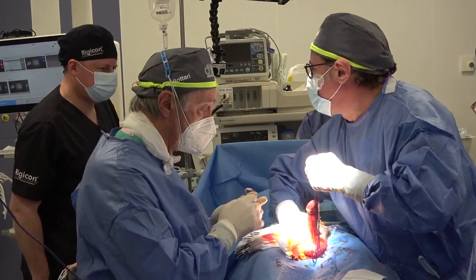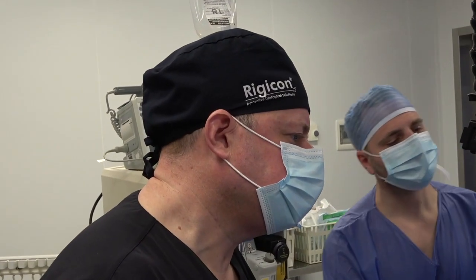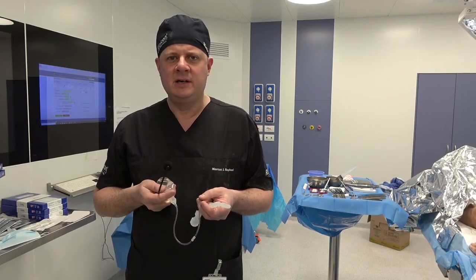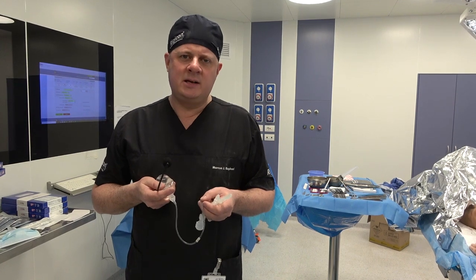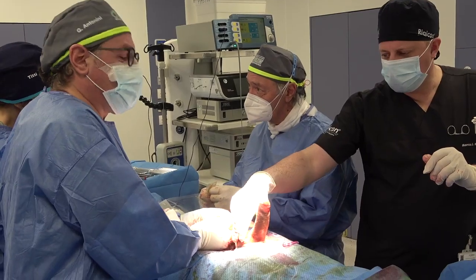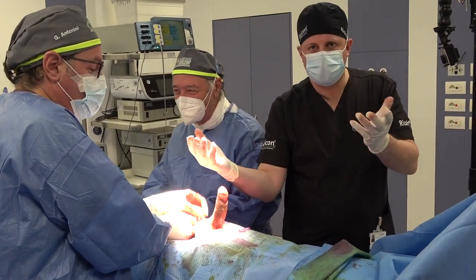Obviously with the implant being implanted, it really gets to do its job. And with a 20 cm that we've implanted with just 2 cm rear tip extenders, we've really ended up with a very, very nice result here. I think this patient will be exceedingly happy with his new Infla 10.